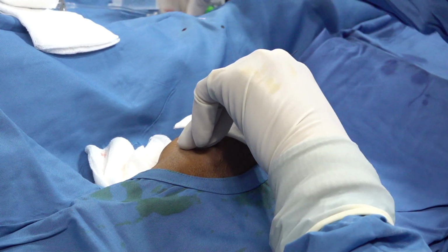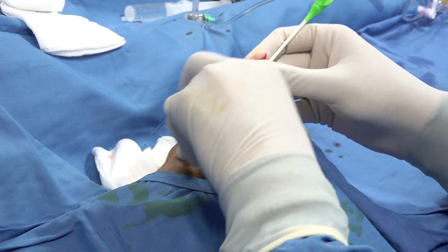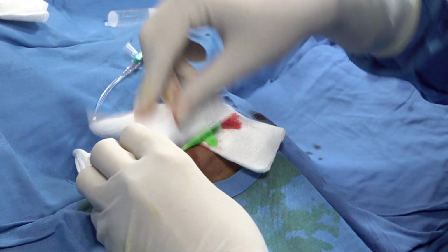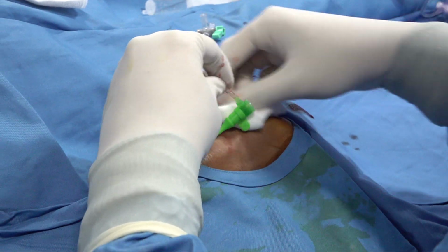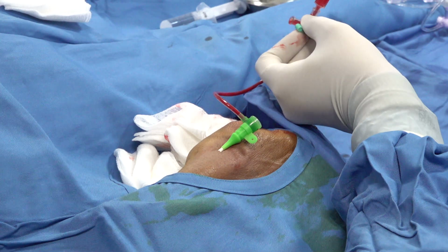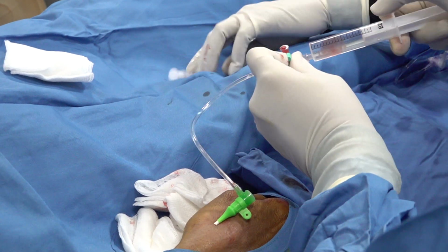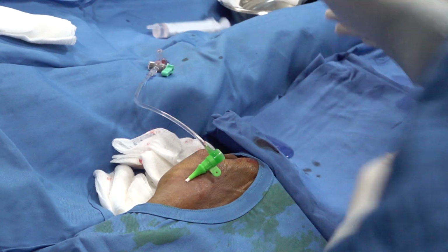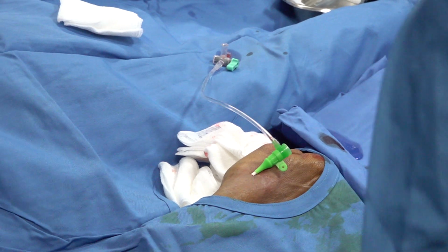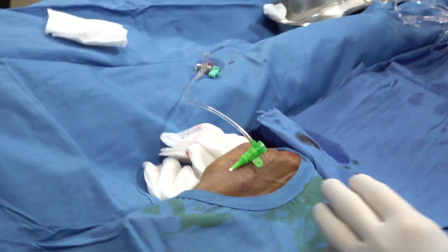I think Sanjay has the best counterpunching technique. I agree with that. I learned the counterpunching technique from him also. I think me too, I can say that. Thanks. I think the trick for the distal puncture is to set up the hand vertically to the patient. Is it true, right? Yes. That facilitates it. And anywhere we get the best pulsation, that is the site we puncture, not a particular point.